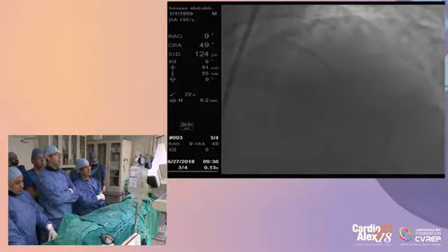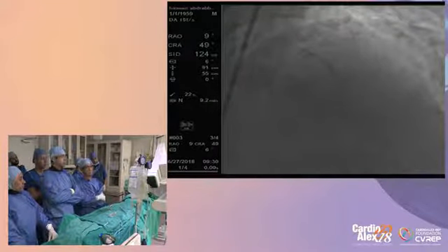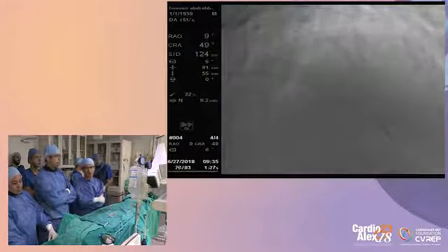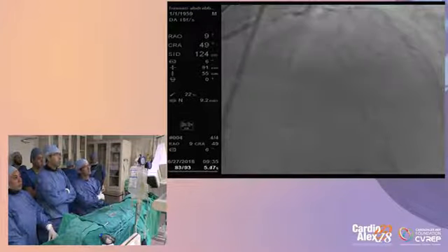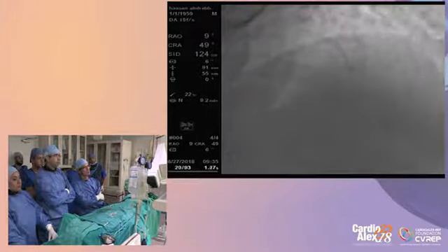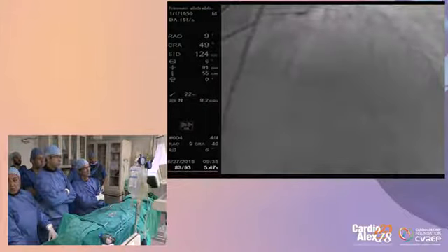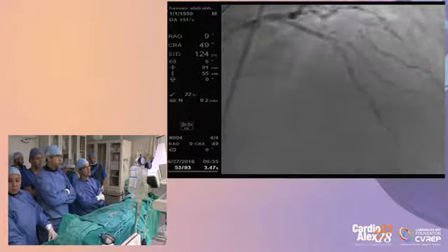So we used a PT2 moderate over a Fine Cross. Usually I like to go directly with the RotaWire, but since it was occluded, I didn't want to hurt it, and we considered it was faster and safer to go through a first wiring.